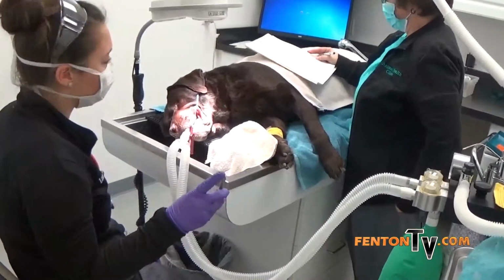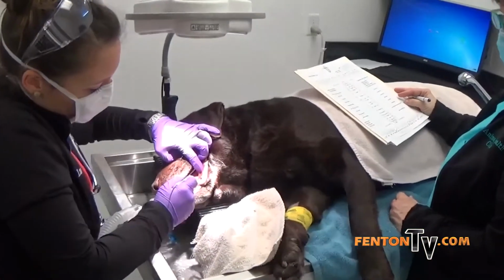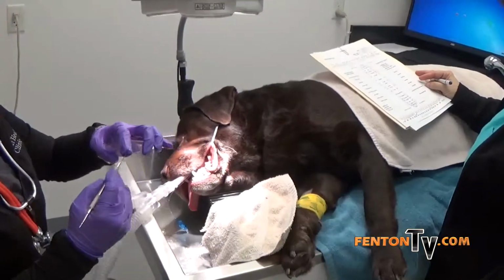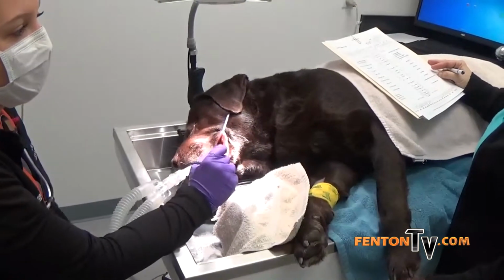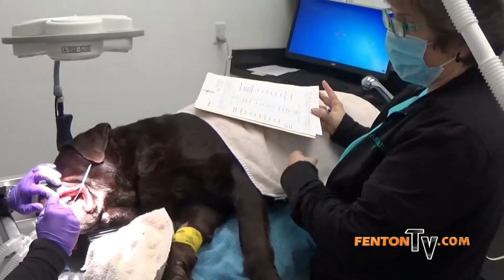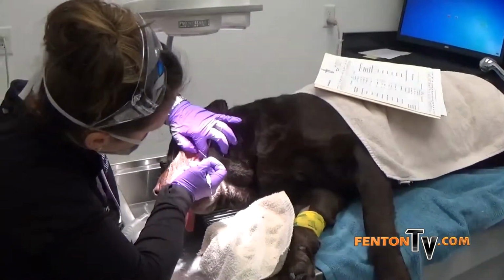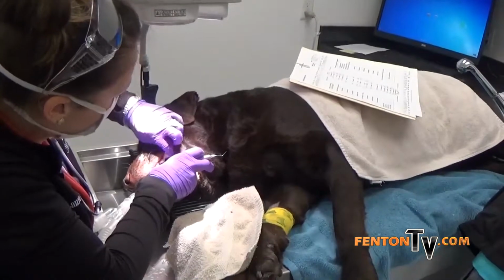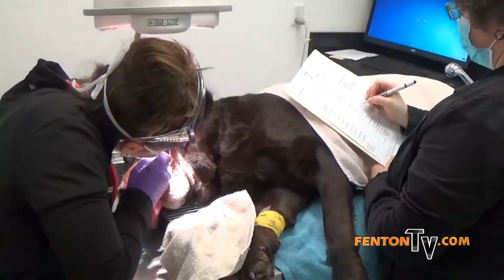And we check their pocketing, which means their gingival pocketing. So I can get this under the gums on a certain distance on this tool, and then we put it there. And if there's anything concerning or a really deep pocket, then we will take a radiograph of that tooth. Where are you starting? I'm starting left top all the way to the back.